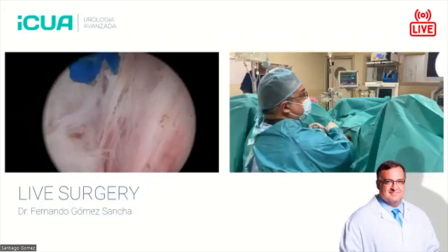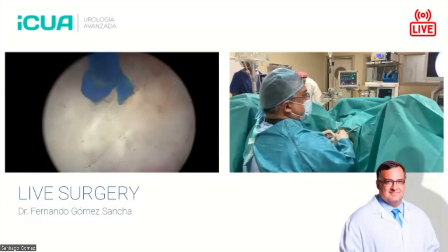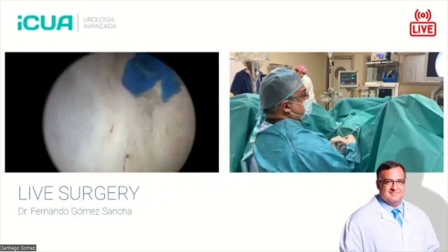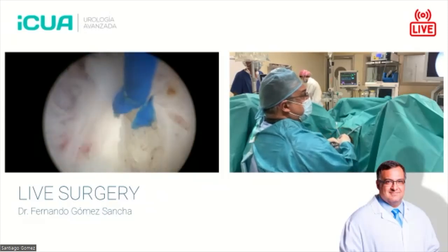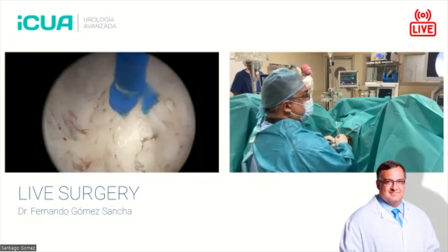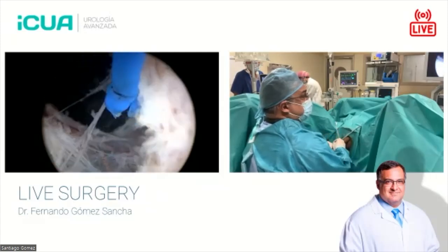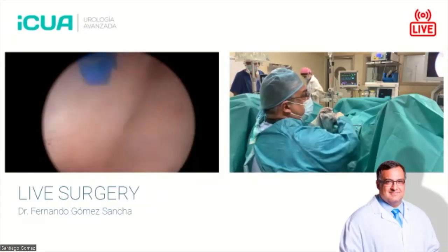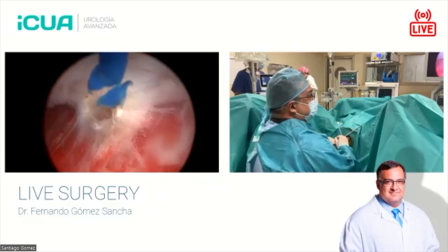Well, yes, everybody can choose their preferred settings, depending on what they value most. I like the 2 joules because they give me a nice push, a nice peak power that will produce a nice bubble and a nice dissection effect. Maybe in terms of hemostasis, with virtual basket, it's really a big change for the better, no? Yes. Now hemostasis is really, really good.